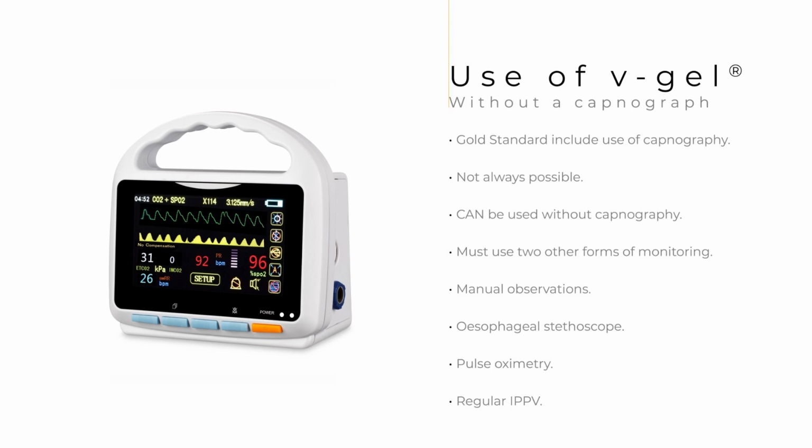In this circumstance, we would recommend other forms of monitoring. Manual observations, use of stethoscopes, use of pulse oximetry. We also recommend that IPPV is performed regularly throughout the procedure to confirm the placement of the device and to ensure the lungs are fully inflated.